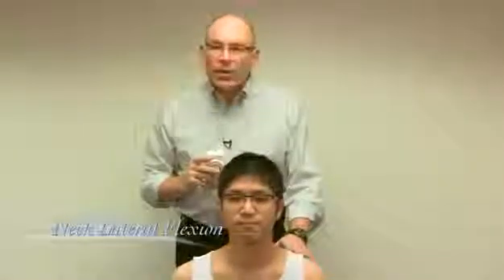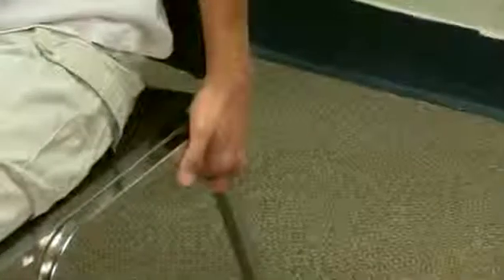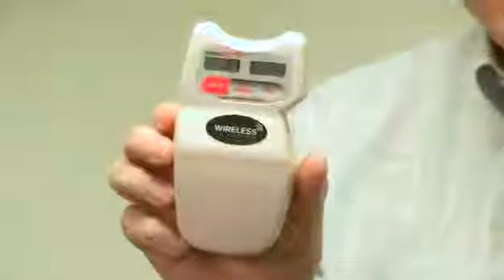Continuing on, now we're going to measure neck lateral flexion. To get out any body English, I'm going to have the assistant stabilize the patient's shoulders to minimize any movement that occurs at the trunk. I place the inclinometer on the top of his head and hit the button. Sir, bring your left ear towards your left shoulder. I hit it again, bring it up, and hit it one more time. He had 47 degrees of left lateral neck flexion.